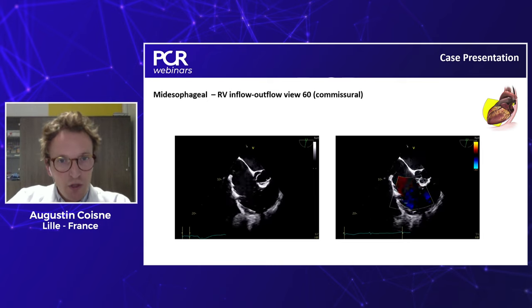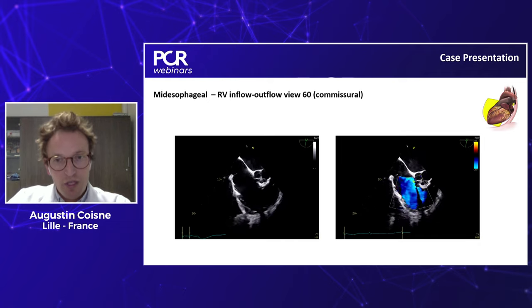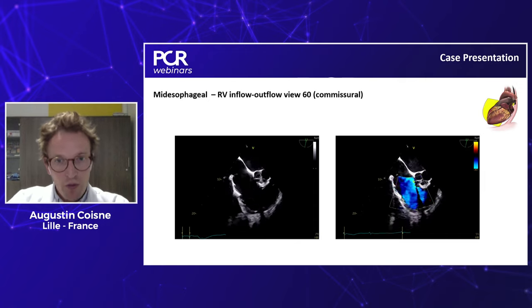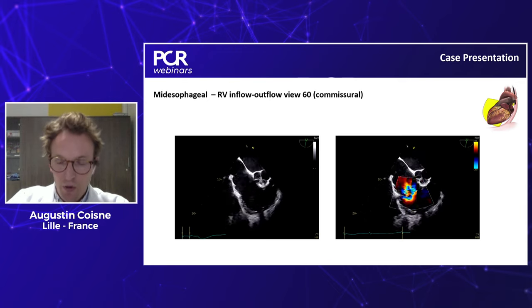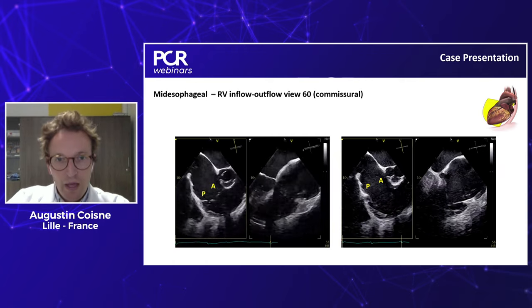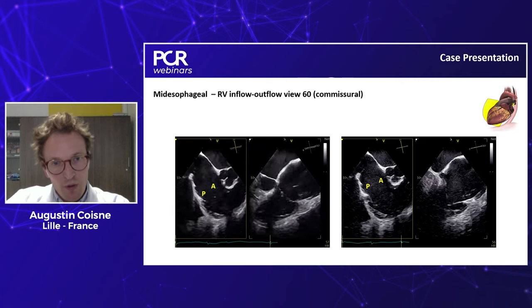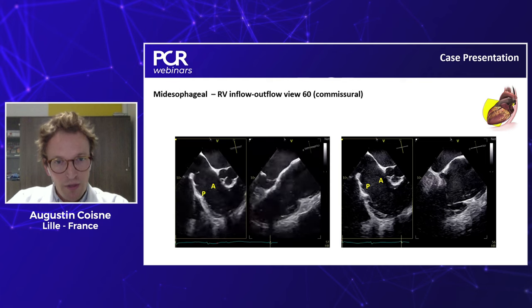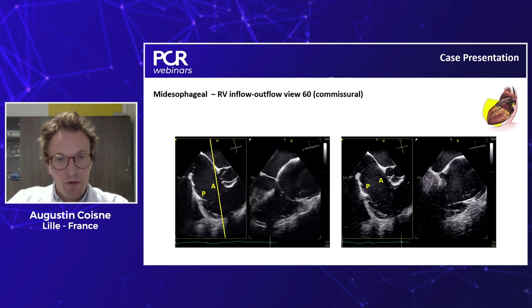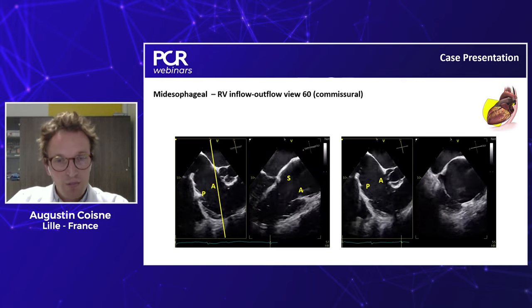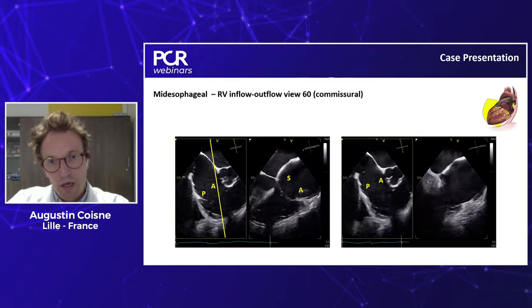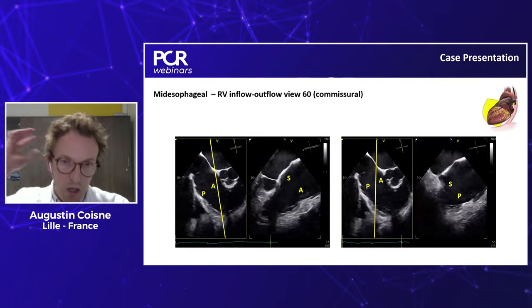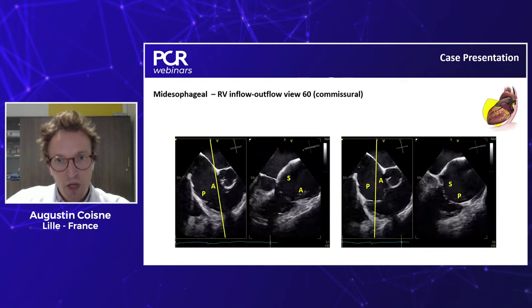We started with the mid-esophageal RV outflow view, also called the inflow-outflow view, achieved by centering the tricuspid valve and rotating to 60 degrees. With the aorta as a landmark, we have the anterior leaflet close to the aorta and the posterior leaflet on the left, separated by the anterior papillary muscle. Using biplane on the anterior leaflet gives us the septal and anterior leaflet; moving the line to the posterior leaflet gives the septal and posterior leaflet. Most of the gap was between the septal and anterior leaflet.